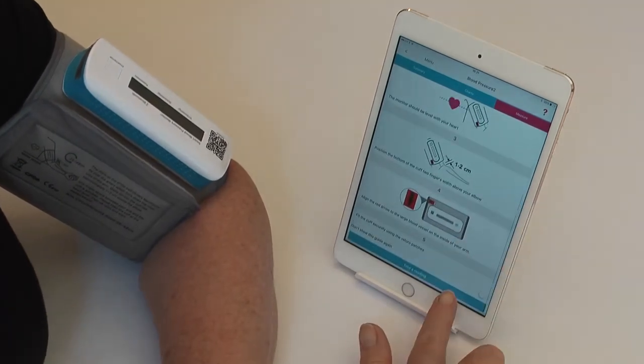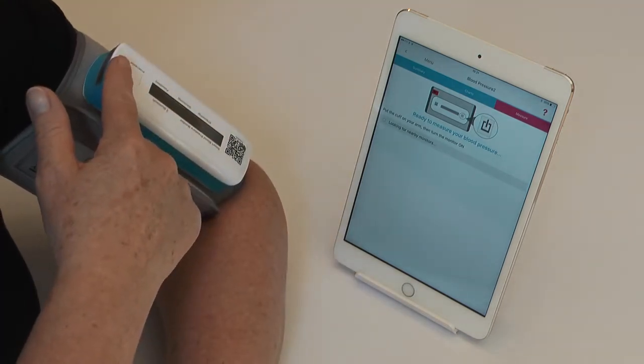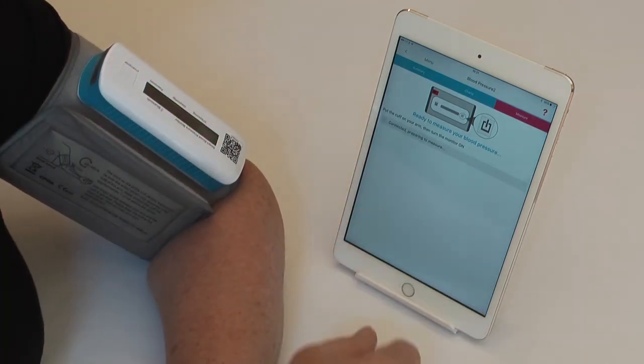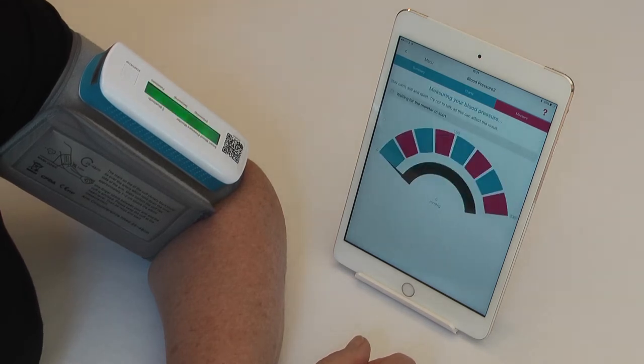Put the cuff on and then press 'Take a Reading' at the bottom of the page. It is looking for nearby monitors. Turn the blood pressure monitor on at the start/stop button. If the serial number corresponds, touch it and it will then start connecting by Bluetooth and then it will start the measurement.